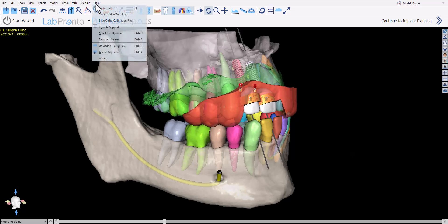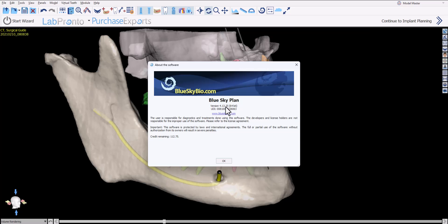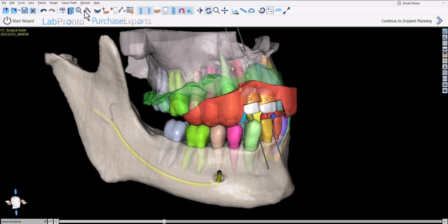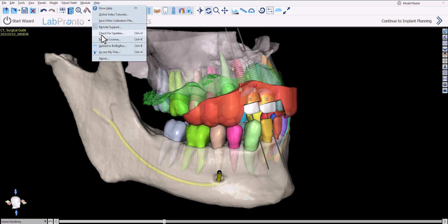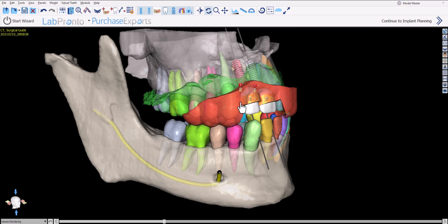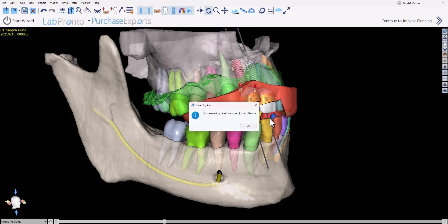For this tutorial I am using version 413.35 of the BlueSky Plan software. If you're not using this version or if you're not sure if you have the latest version, simply go to Help, Check for Updates. The software will let you know, and if you're not using the latest version you'll be prompted to download and install the newest version.